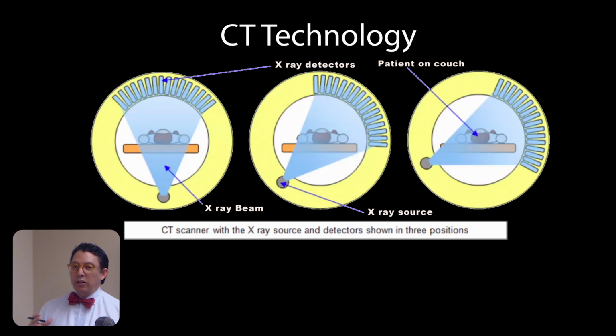So how does CT technology kind of work? Again, we had this beam, which was an X-ray. You put it into this round structure that went around the patient, and you rotated it with slightly different angles, and the detectors on the other side would also do that. And then a computer would just see the information that was coming from that to reconstruct the images with very complex mathematical algorithms.